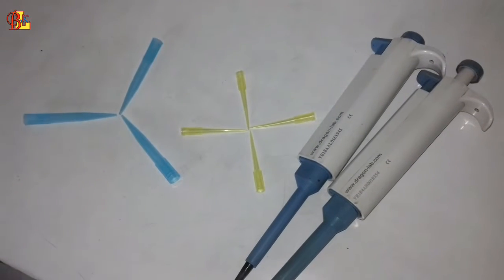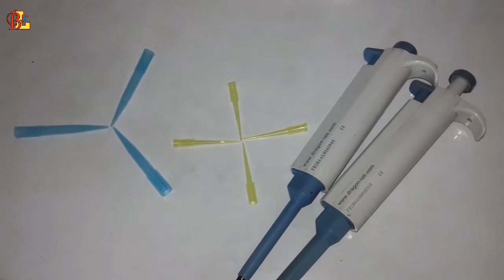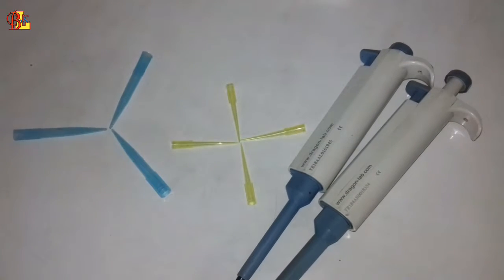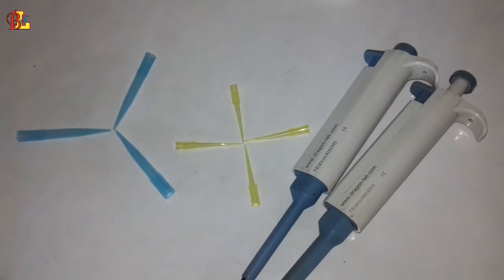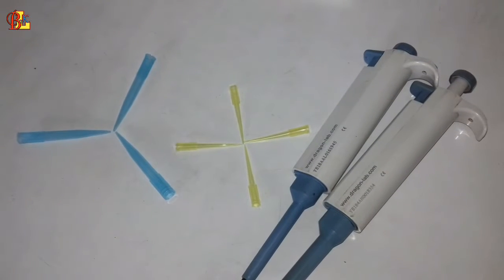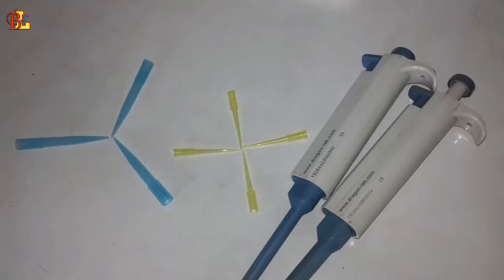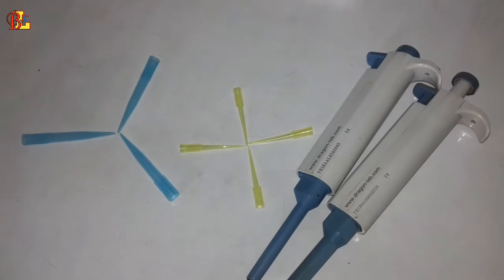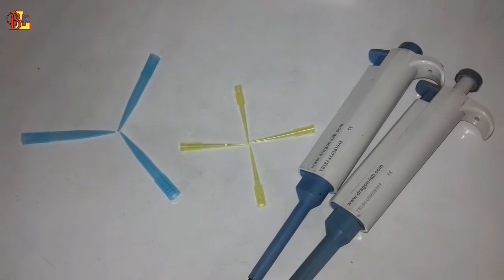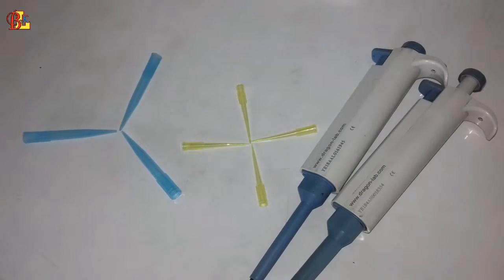Hello friends, welcome to BK Laboratory. I am Vikas. In this video we are going to learn how to do a blood albumin test. I have previously given many videos on pathological tests through the BK Laboratory. If you have not seen those videos, please visit the channel and watch them all.